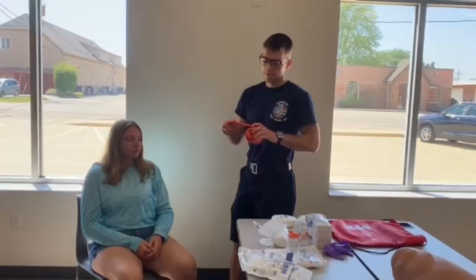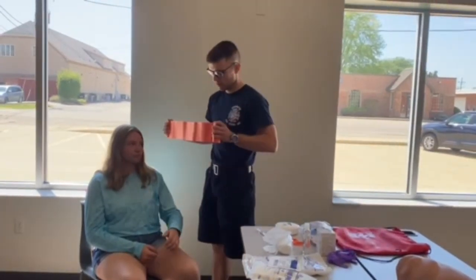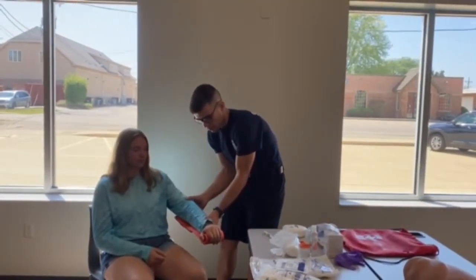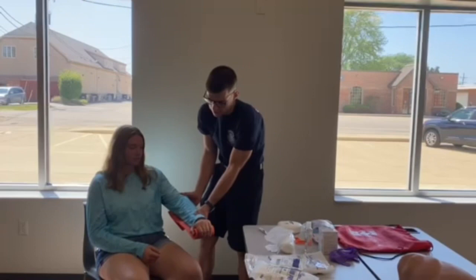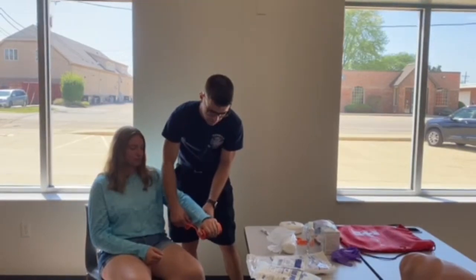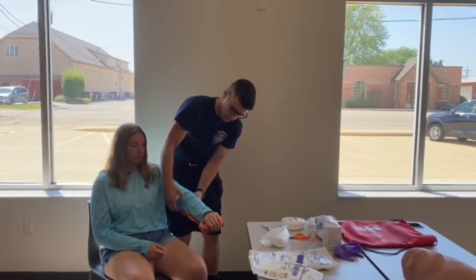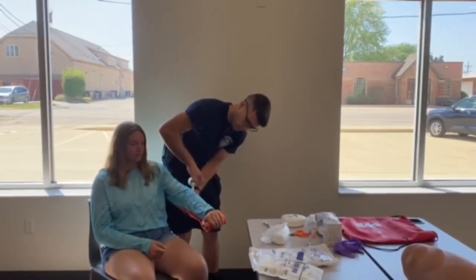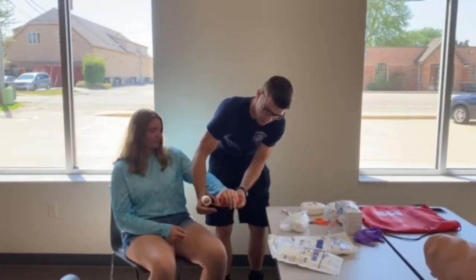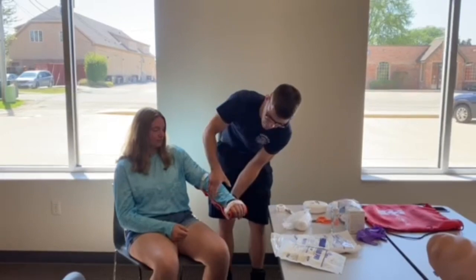This is called a SAM splint — it's a malleable splint. In this case, say someone has a wrist fracture. Unroll most of the splint, place it in their hand, fold it back on the elbow to immobilize that part. Once it's positioned, have someone hold it while you secure it. You can use either tape, roller gauze, or preferably both. Just tape it on, being careful not to put tape directly on the injured wrist. Add more as needed.